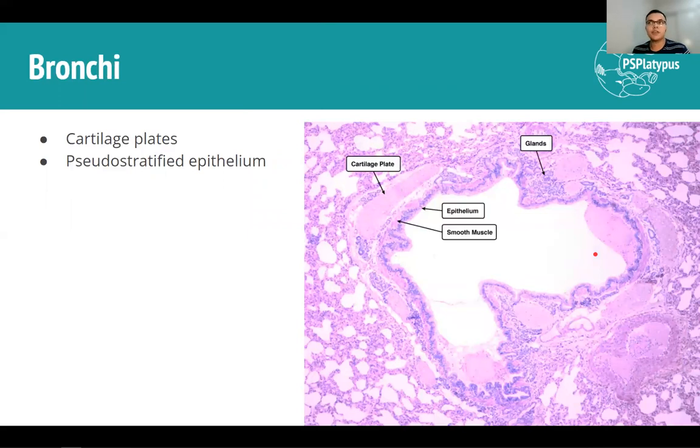Next up, you have your bronchi. Your bronchi consist of ciliated pseudostratified columnar epithelium. So notice how the same cell type is here, which makes it already easier to remember. Again, they're still ciliated because they're still forming part of the mucociliary escalator. This time, however, you can make out some smooth muscle, because the smooth muscle is going to be responsible for contracting and relaxing to allow the airway radius to change. And if you had a look at our breathing biomechanics video, you would notice that that was important for controlling how much air was coming into and leaving the lungs.